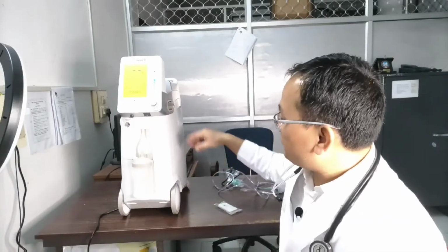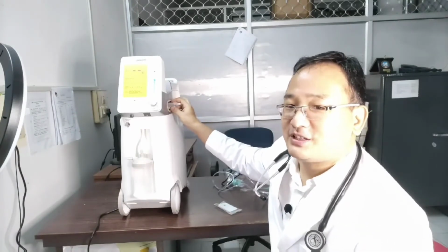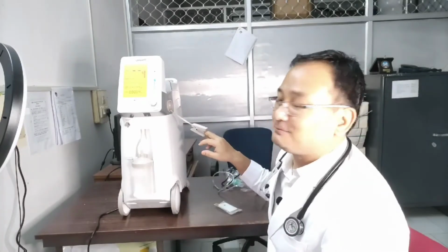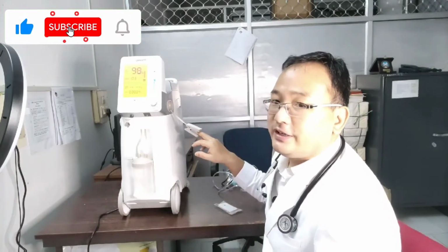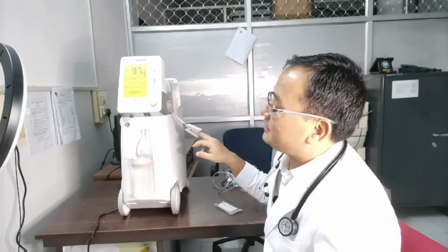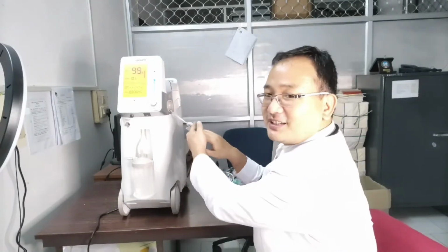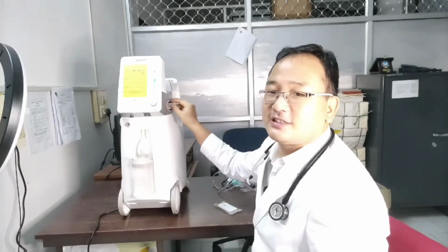So first of all, let me check my oxygen saturation through this pulse oximeter. This is the pulse oximeter that is attached. I'll put my middle finger and let's check the display screen. Let's wait for a minute. You can see as I put my finger inside the pulse oximeter, the oxygen saturation is showing 97, 98 and 99%. So I am doing well. After I have checked my saturation, I'll put this back in its position.